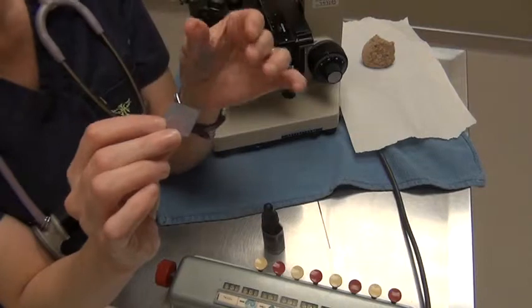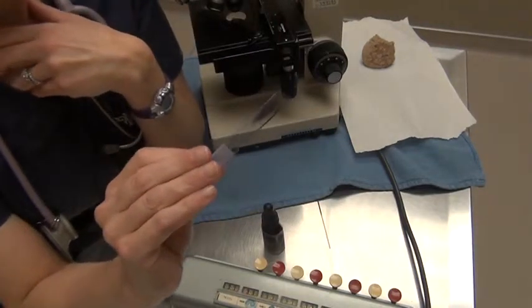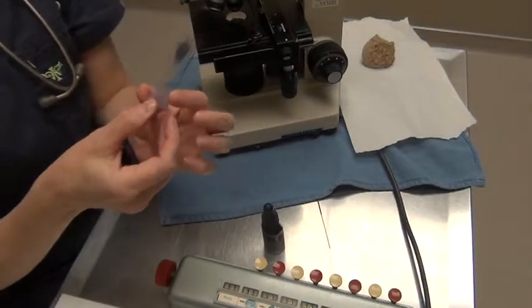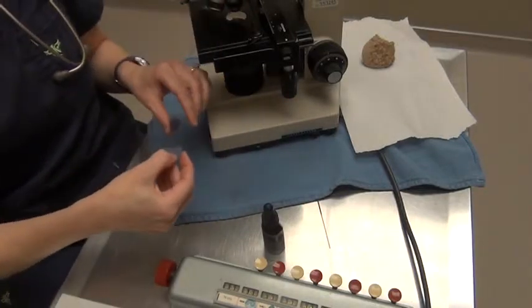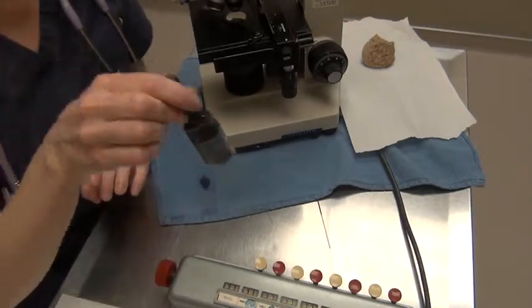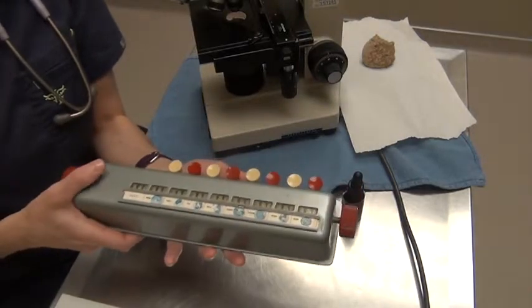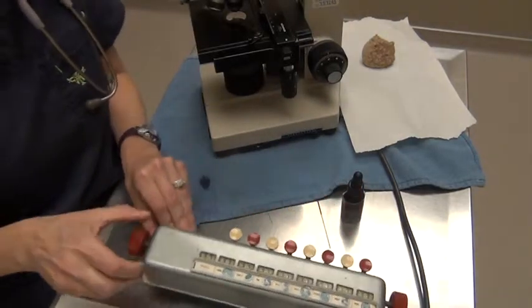I used the DifQuick kit to go ahead and stain this, and it did properly air dry, and it's ready to be looked at. So what we'll do is we'll go to our microscope. We've got other supplies needed for this particular test. We've got immersion oil to look at it, and I also have a white cell differential counter. So I've got one of those.